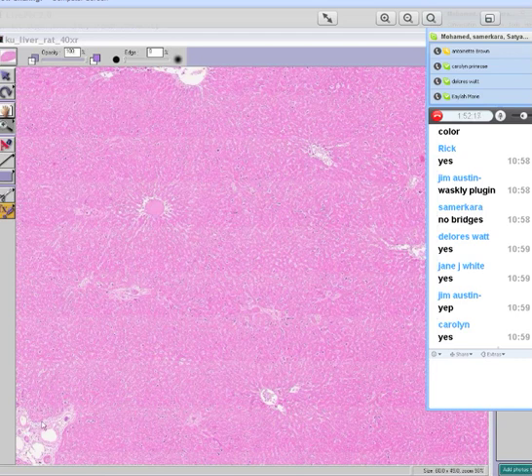That's the first thing that you notice. And also notice, number two, when you look at portal veins like you see here in the extreme southwest, make sure that the connective tissue is limited only to the portal vein area.